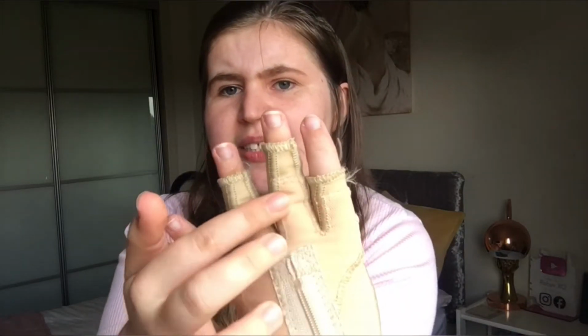Without my hand strap, I will put a picture here, I'm sure I've got one, these fingers bend, you can kind of see them bend there, and my thumb doesn't fully go back. Over the years of using these hand straps, it has helped it go out further, but that is the main reason why I need to wear this hand strap, because if I don't wear it, my hand can go back to what it used to be, and then I will need to wear a metal case here.